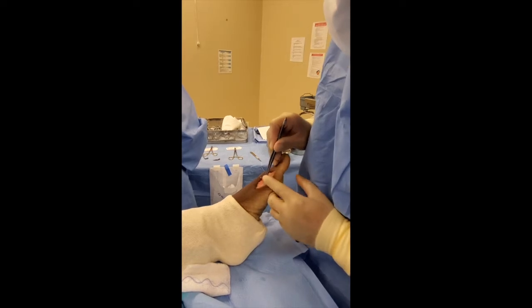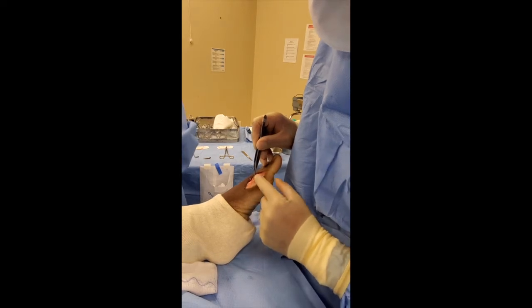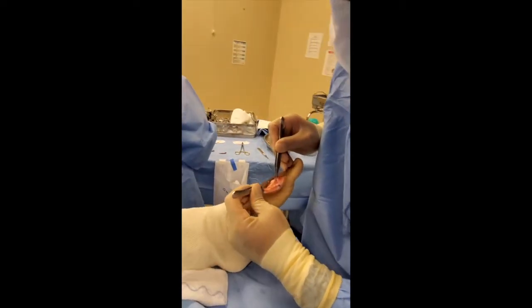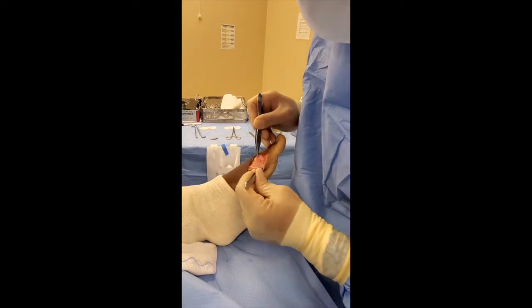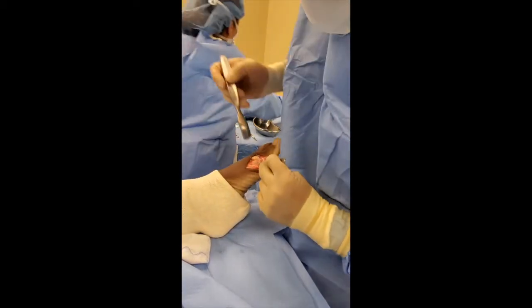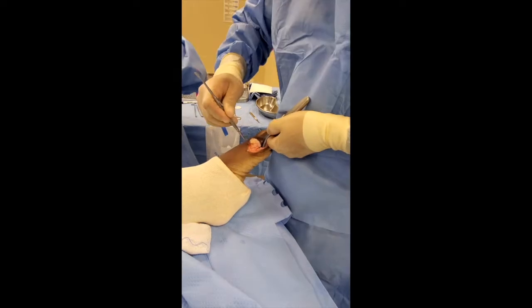Feel that bone above the red line. What we did is we made the skin incision, took out a wedge of skin because it was so bulky. After that we separated the subcutaneous tissue from the deep fascia — cut on the top here all the way down, then straight down this way, with the other side right over here. We very delicately took this tissue away from the bone, exposing all the abnormal bone growth. You can see how much abnormality there is on the first metatarsal head.